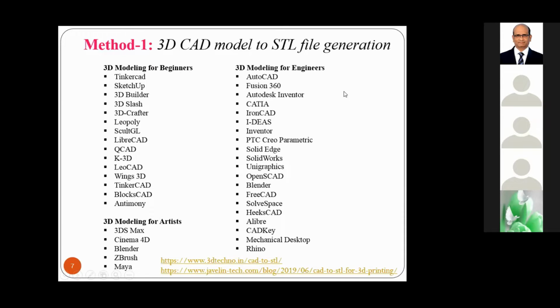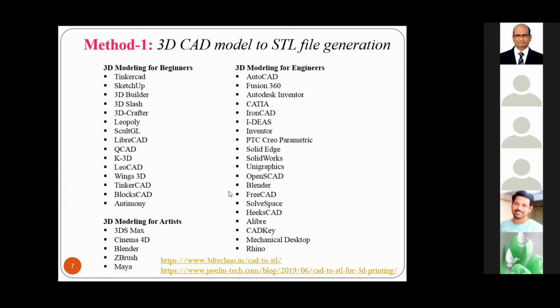Now you can see here, may I show them here? This tool, is it visible in the PPT properly? Yes, sir. Okay, thank you.